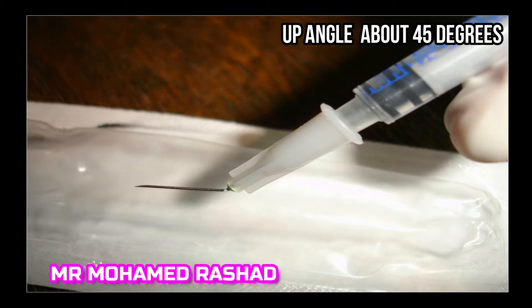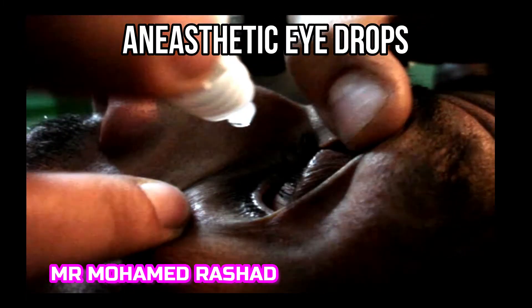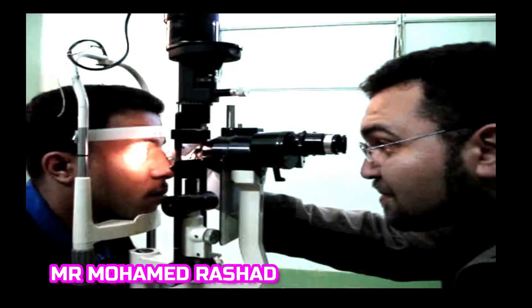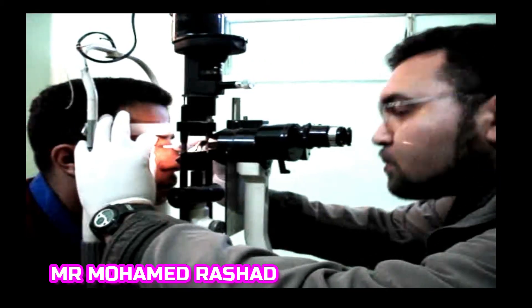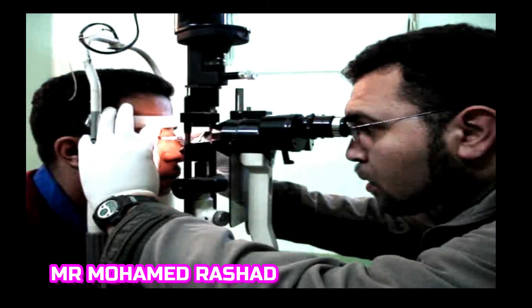This will make it easier especially when removing the foreign body at the slit lamp and helps avoid the nasal bridge. Begin by applying topical anesthetic — either proxymetacaine or other anesthetic drops — and make sure you are holding the eyelids very well. Some people may use a speculum.